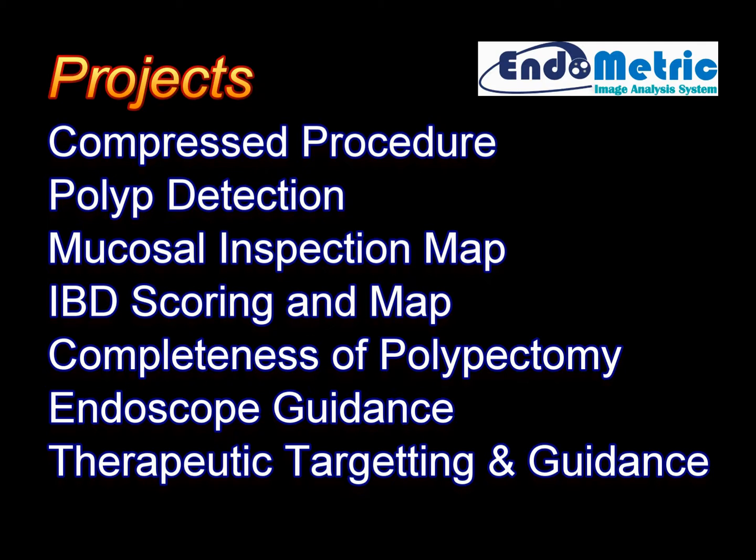Because the EMIS technology gives complete control of every pixel, EndoMetric can create very dense video compression with virtually no loss of information. Compression may simply be a clear frame along a specific colon axis distance, resulting in 100 to 1000-fold compression. Given such compression, all procedures ever performed in the lifetime of a single endoscopist could fit on a single hard disk. Automated polyp detection may increase adenoma detection rate.